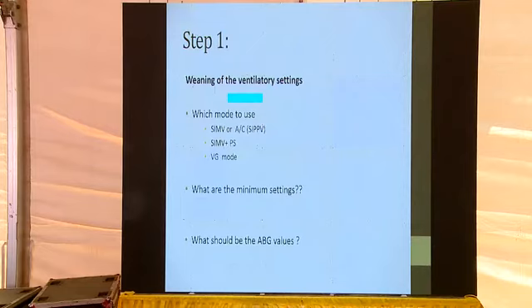The reason being, in pressure support, I am only boosting the breaths. I am not deciding the inspiratory time. I am not deciding the expiratory time, only deciding the pressure.